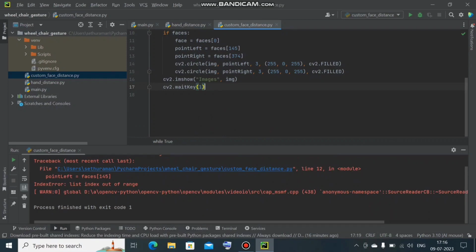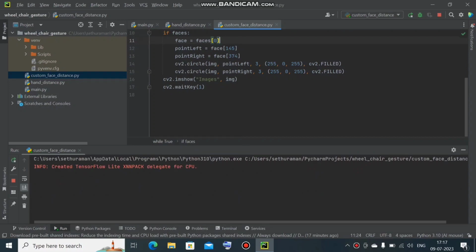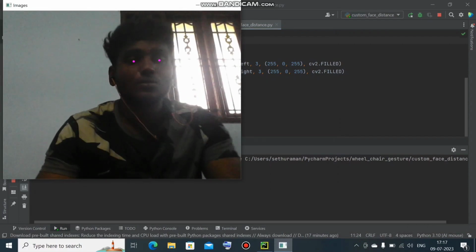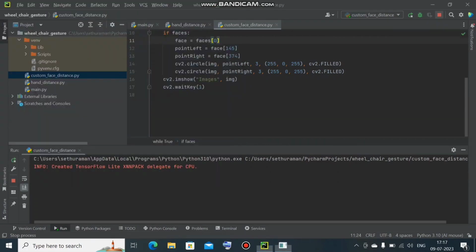Oh, list index out of range. Oh, sorry, here I need to fix it. What's the error here: I have assigned face as the variable where faces is lying, so here I need to make it face, not faces. It should work fine now, I guess. Okay, yes, these are the 2 points in my eyes, the middle of the eyes.